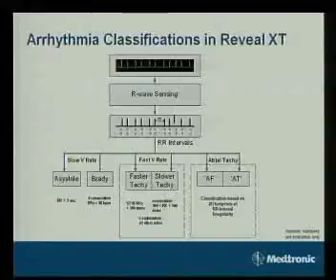complex. And then, of course, the slow rates, where you have asystoles and bradycardias, is very easy to detect. Fast ventricular rates are also easy to detect. It's a matter of timing, where you have fast and very fast tachycardias.